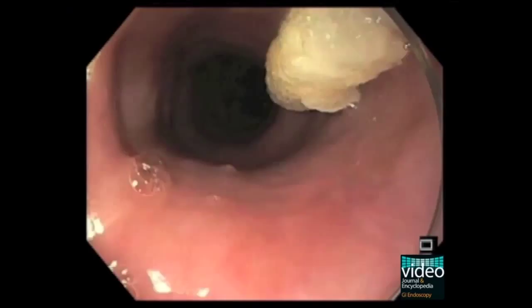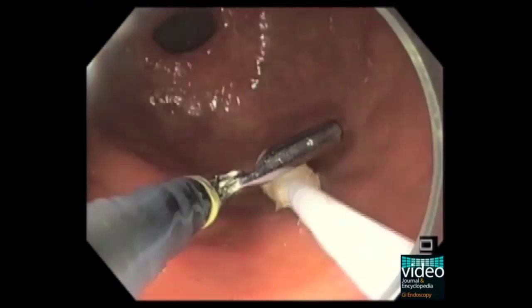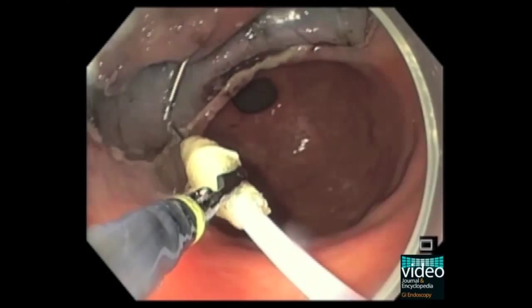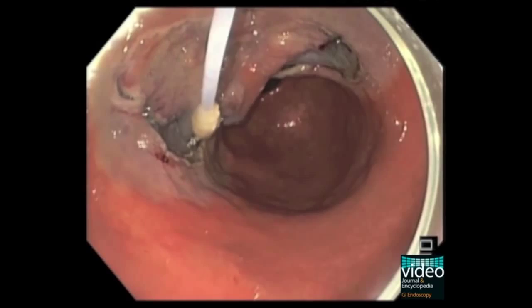In order to orientate the snare, a foreign body forceps is inserted through the endoscope working channel. With the orientation of the forceps, the clip is grabbed by the snare. Due to the moderate stiffness of the snare, the partially resected lesion can be pulled or pushed, exposing the luminal side and the submucosal space.